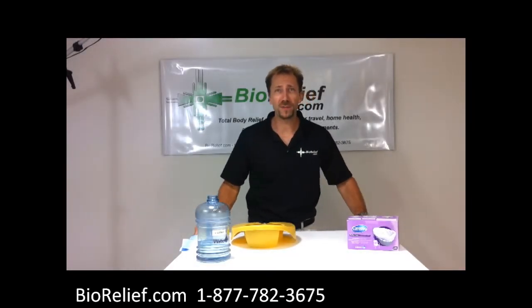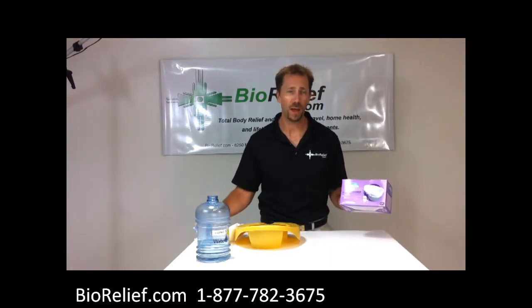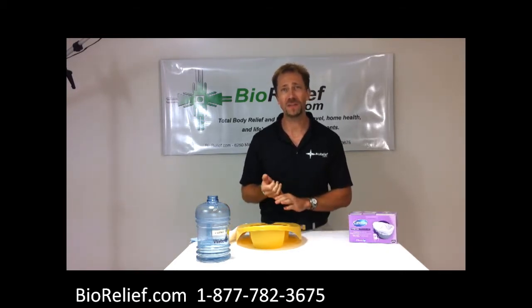Hello, my name is Jeff with Biorelief.com, and I'm going to be showing you today the Carebag Bedpan Liner. It also comes with a commode liner, and it's pretty much the same size, but the idea is that it makes cleanup much, much easier for caregivers and facilities.